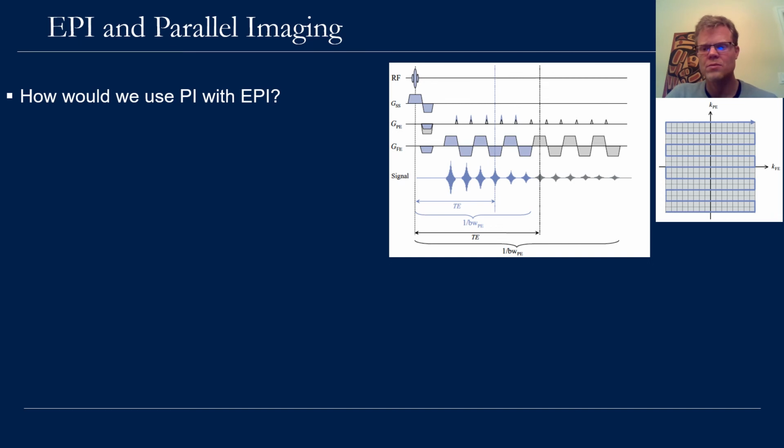And so what we see is we're doing the zigzag in k-space, but we're jumping 2 grid lines every phase encoding step, where we have slightly larger phase encoding blips compared to the gray sequence. And this allows us to shorten the echo time, reduce the total readout length, or in other words, increase the bandwidth in the phase encoding direction.